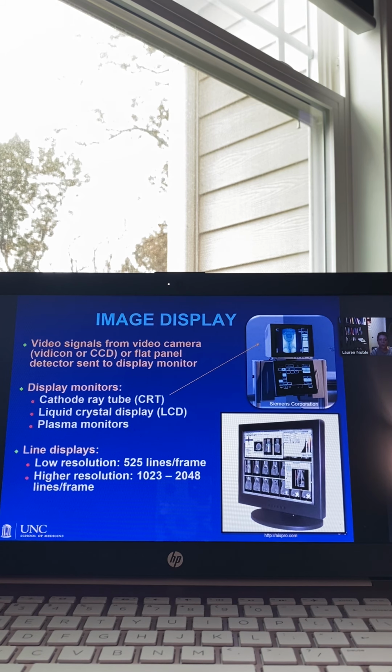The pixels are smaller, so we have a higher resolution, because of the type of technology built into it in terms of pixel size. And with these monitors, the image is created by that progressive scanning format we talked about, where the electrons are displayed a line at a time from top to bottom, left to right, and ultimately we end up with higher resolution with this technology.